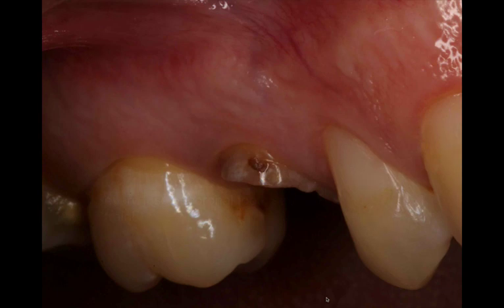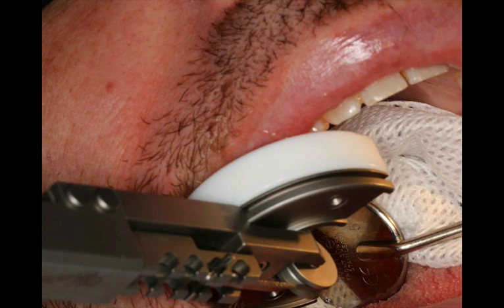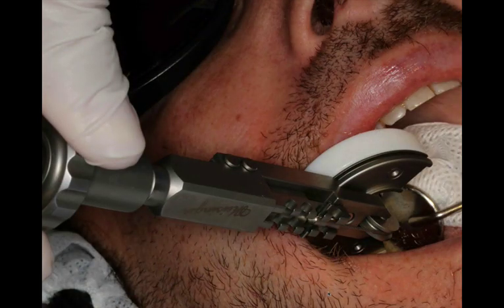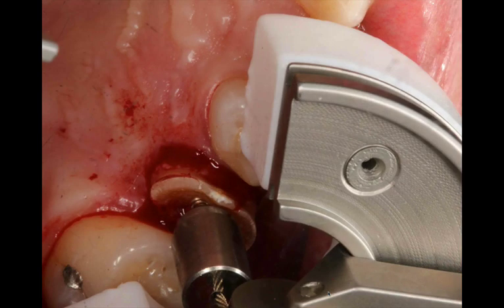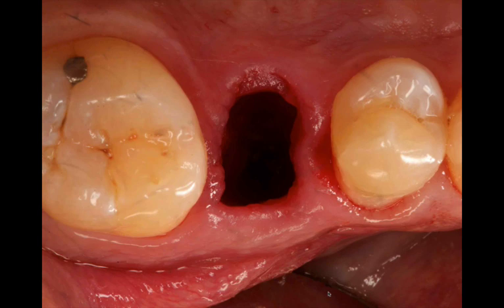This system works really well — you just have to make sure that you connect all the components properly, that your extraction screw is stable within the tooth, and that you have the bumper system laying against the adjacent teeth with the pulley system perpendicular to the occlusal plane. When the root tip comes out in a purely vertical direction, it's a beautiful moment to see a supposedly very hard extraction become extremely simple — to the amazement of the patient. I love using this system and creating those clean extraction sockets.